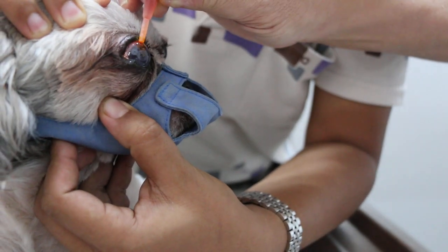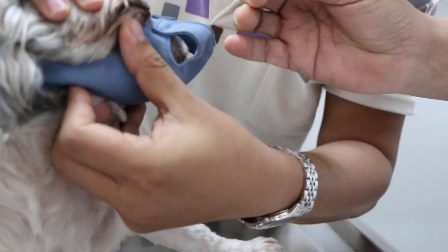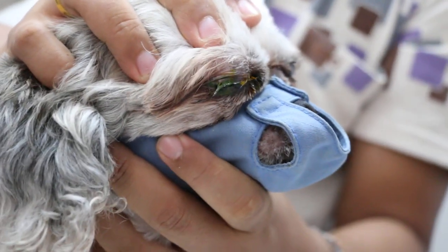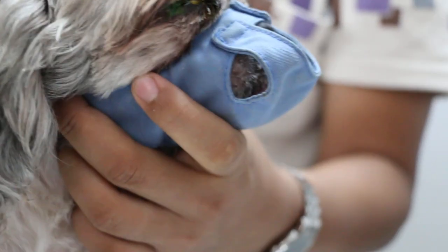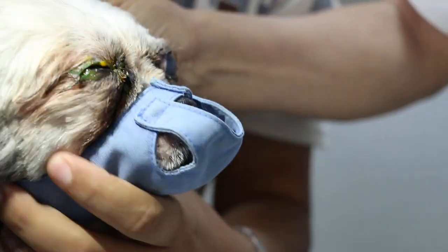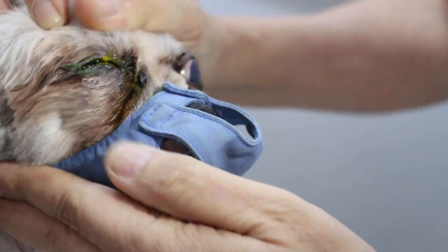This is a test to check the ulcer and see how bad the ulcer is. We wait about one minute. We will see where the stain is. So after one minute, when there is an ulcer, it will become green.